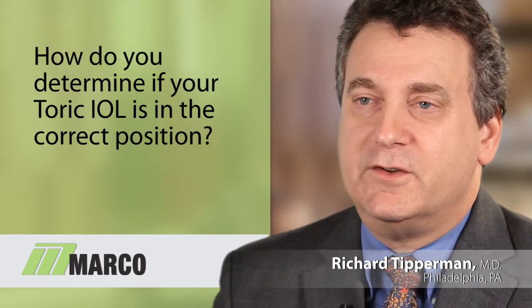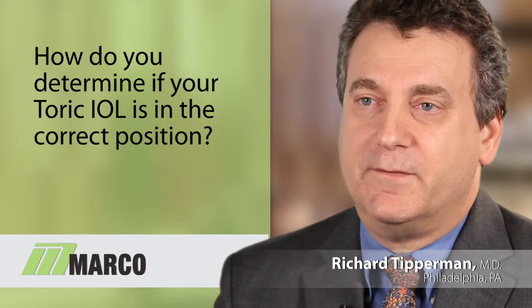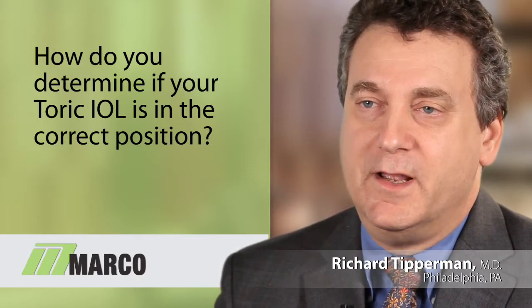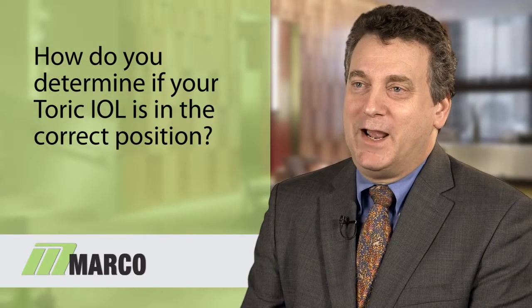Often at courses, physicians will always ask, how do you determine if your toric implant is in the right position following cataract surgery, if it's shifted? To some degree, pragmatically, if the patient is seeing well and doing well, it may not be academic, but I'm less concerned about the position of the toric implant.